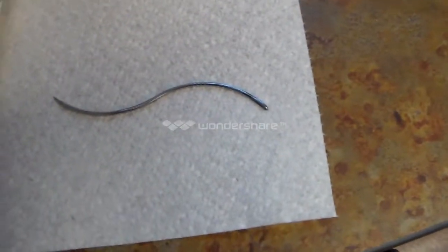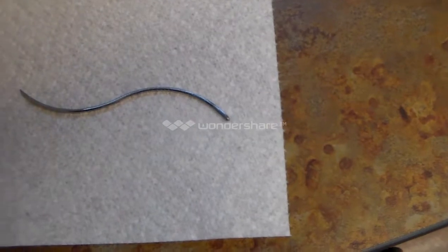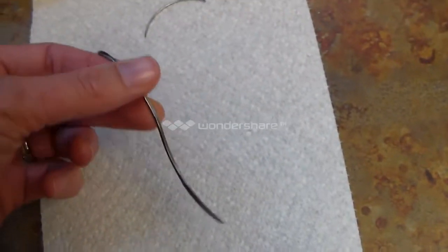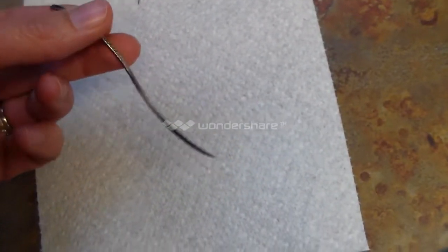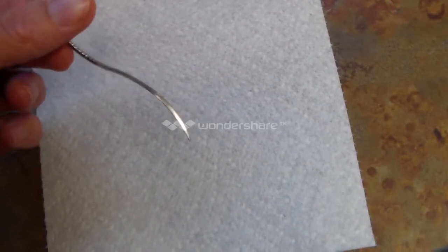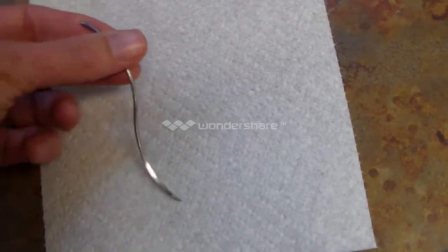These are preferred in veterinary industry. This particular needle, I got this one out as well. This needle is something that's commonly used in large animal. It's large enough to be manipulated in the hands. Of course, you could use a needle holder as well, and this is typically used for skin lacerations and things of that nature in large animals.